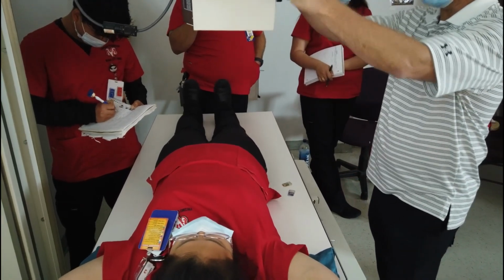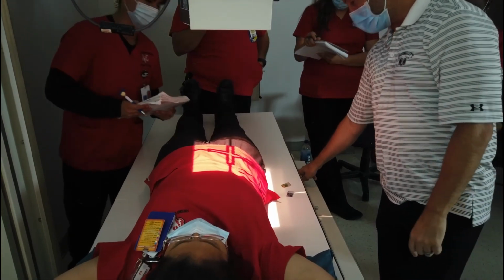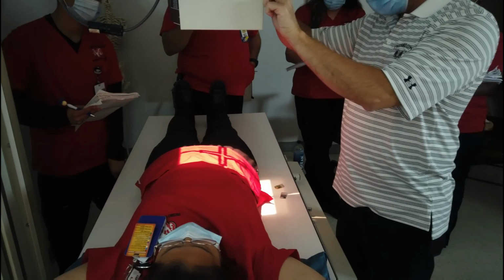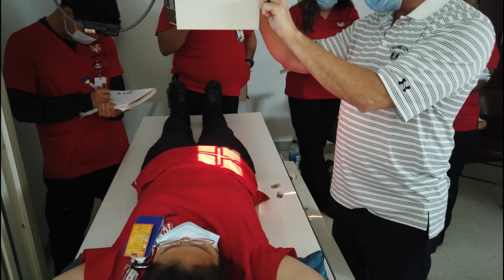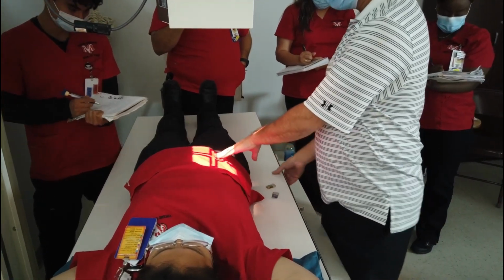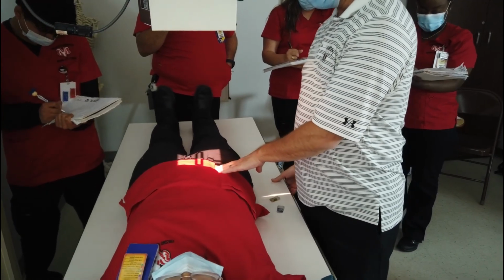Make sure you don't forget to angle. Usually what I see is students fail to angle. You're going to use an 8 by 10 or 10 by 12, depending on your patient. Find the ASIS, go down 1.5 inches to 2 inches, center midline.